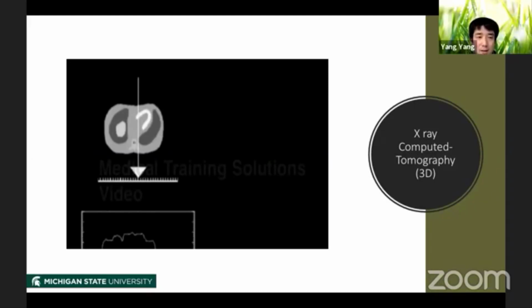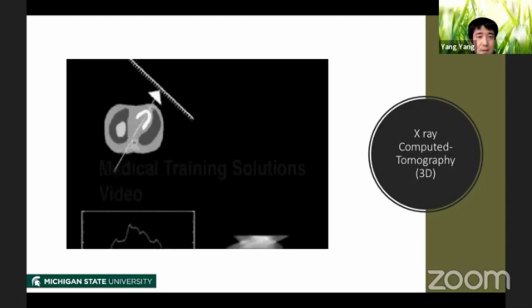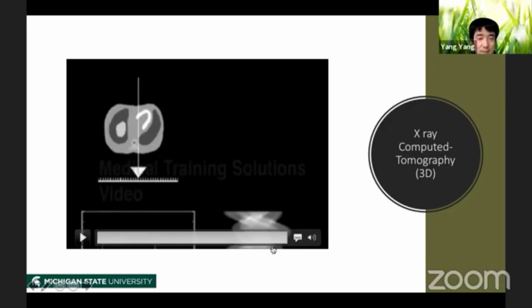Now, the smart idea of the scientists is, instead of using just one projection from this angle, we can use multiple projections. For example, we can rotate the source and the plates to get these images, or the shadows, from different angles. In this way, we get a lot of images, and we stack them at the bottom.